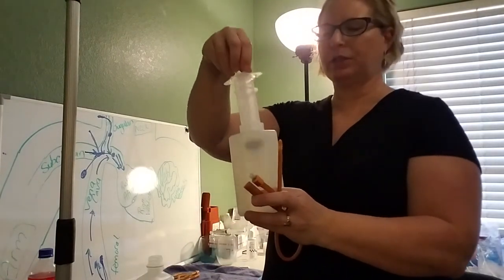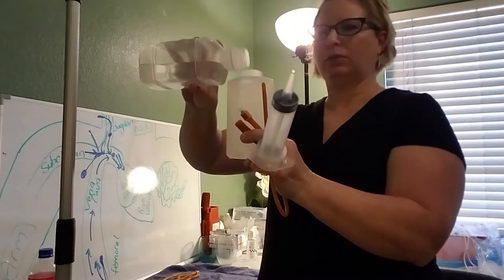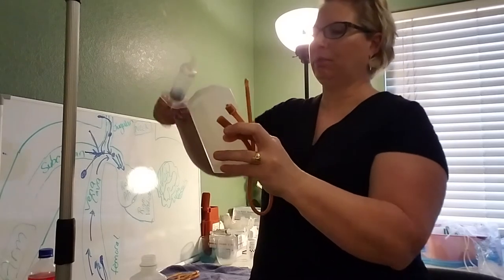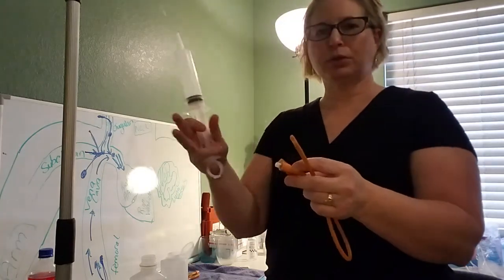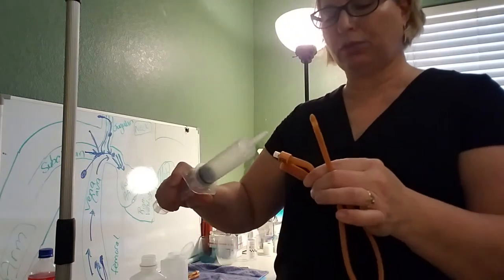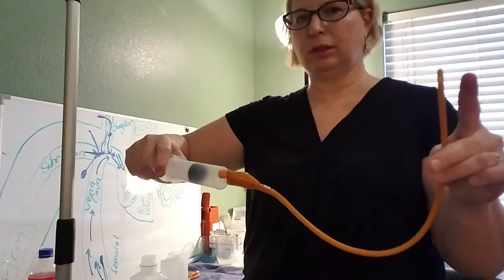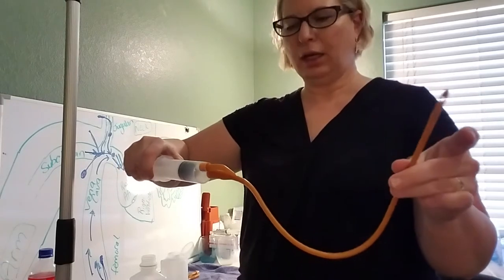You don't need the syringe itself to be sterile — you just need to make sure that the tip of the syringe stays sterile. Hold it to your side, fill this with your sterile saline. I'm not really going to inject sterile saline all over my floor because this isn't actually in a bladder. Keep your syringe tip sterile. You would disconnect this from the Foley drain — it will dribble; there's no way to clamp a Foley and you shouldn't clamp a Foley. Have this ready to go, disconnect this from the drainage port, and then just inject your sterile saline in there. If you are meeting resistance, use gentle pressure to try to get that obstruction — you can push and pull a little bit.